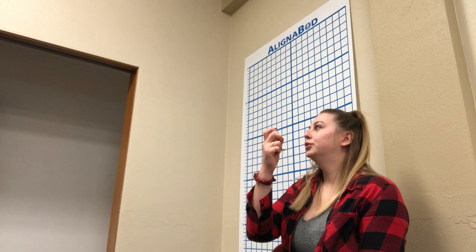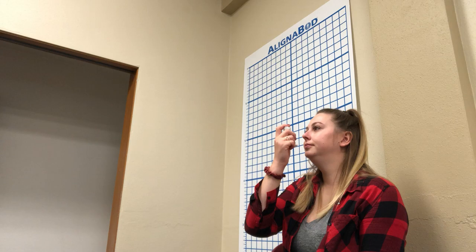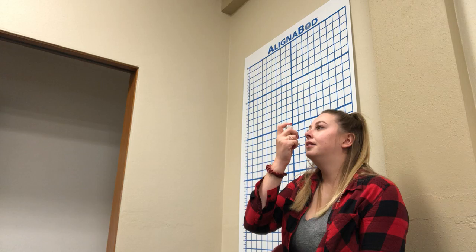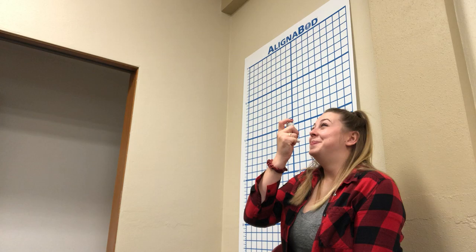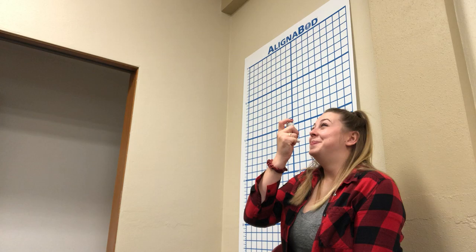Hold the inhaler one to two inches in front of her open mouth, then start to breathe in slowly, evenly, and deeply. Press down on the inhaler one time and continue to breathe in slowly.